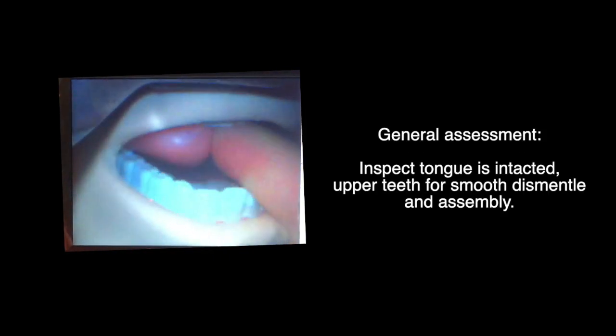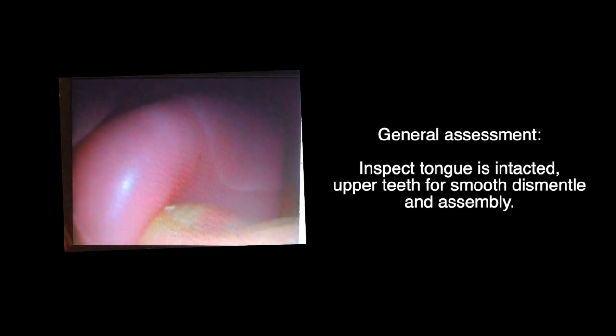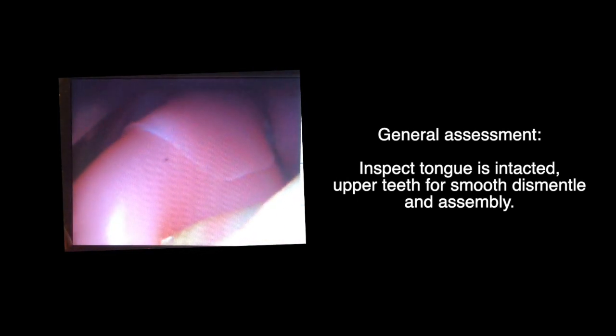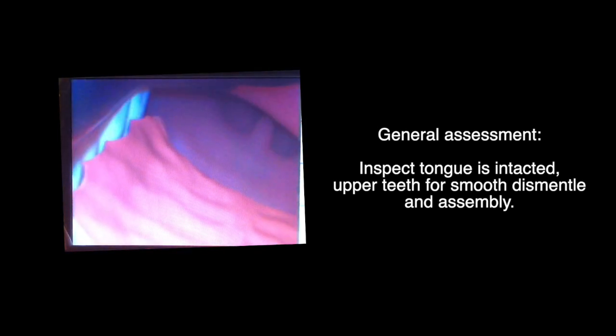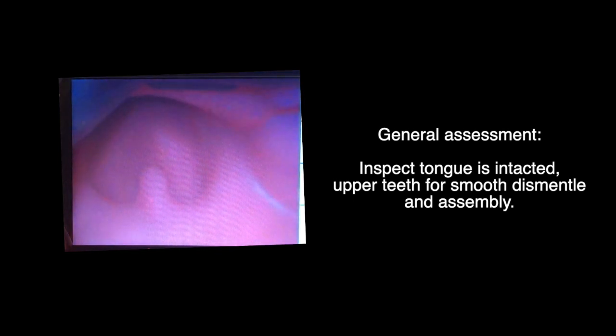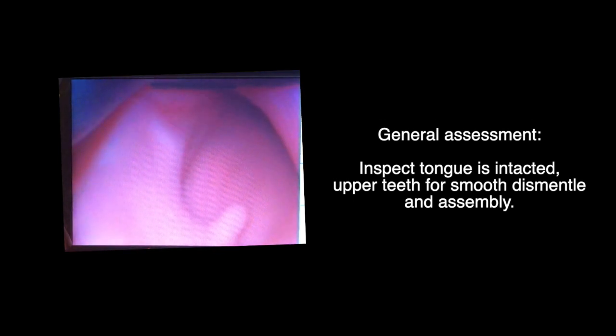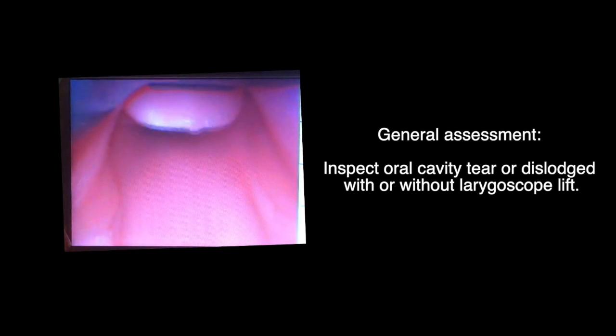My assessment approach initiates with structural assessment followed by functional inspection. So the mannequin's oral and airway examinations commence with lips and teeth inspections. In addition to visual inspections, tactile assessment is necessary to aid exploration of hidden areas and to determine malpositions, internal dislodge or fracture.